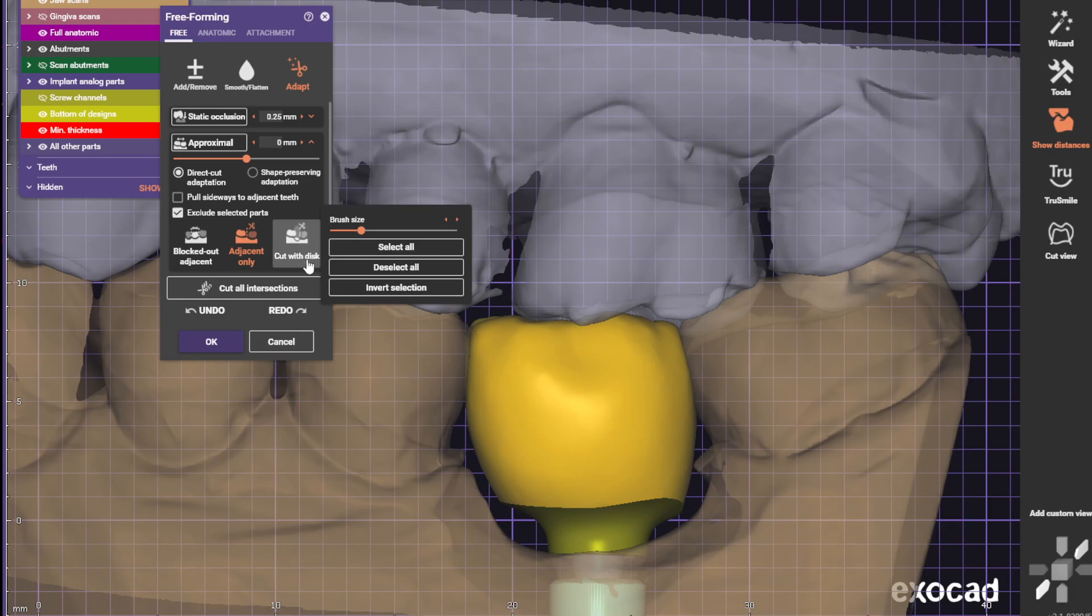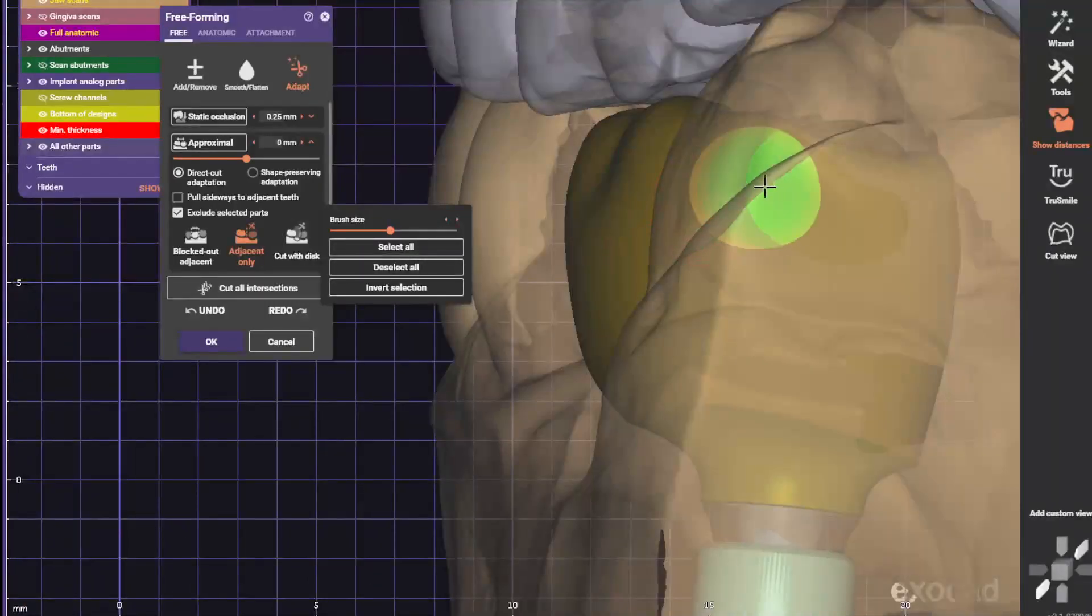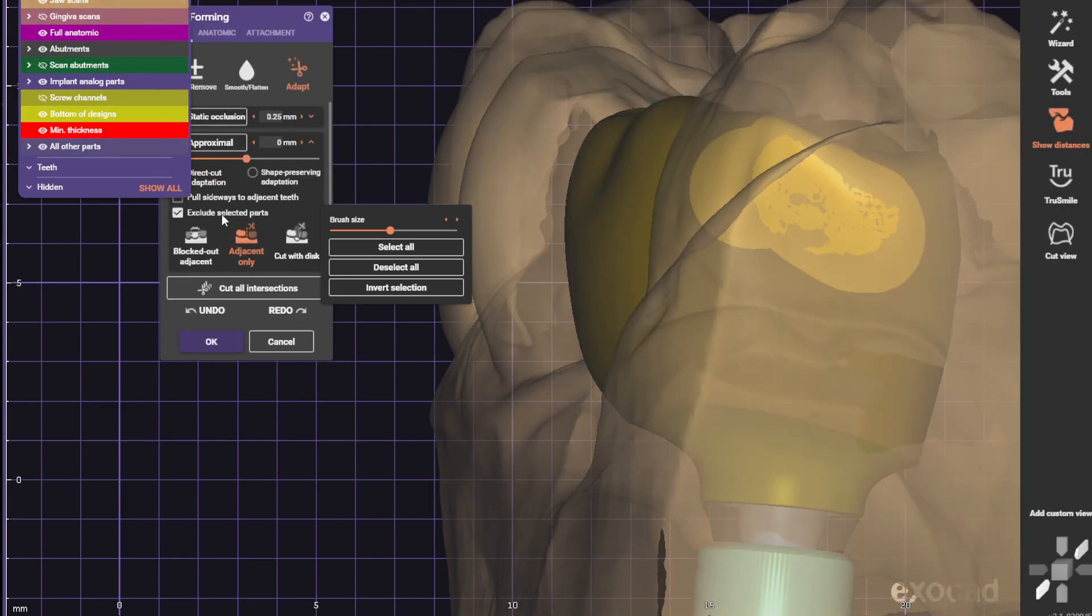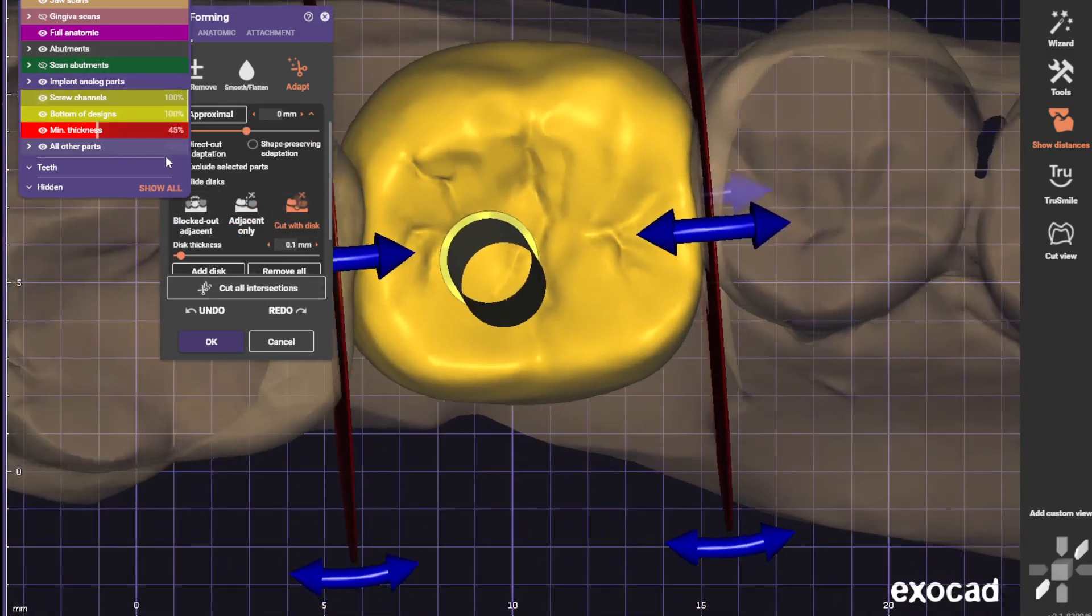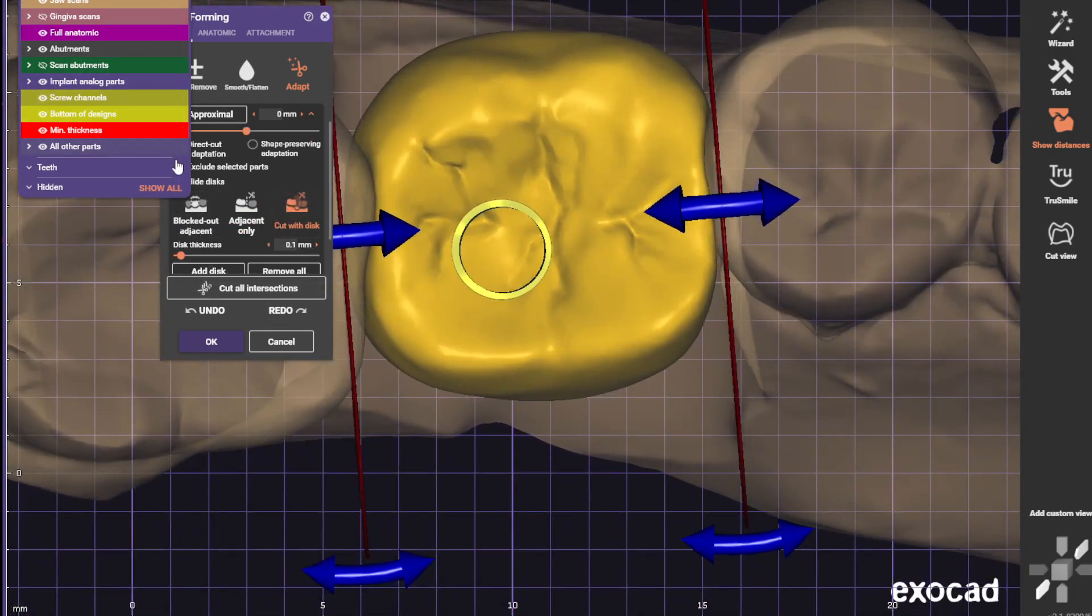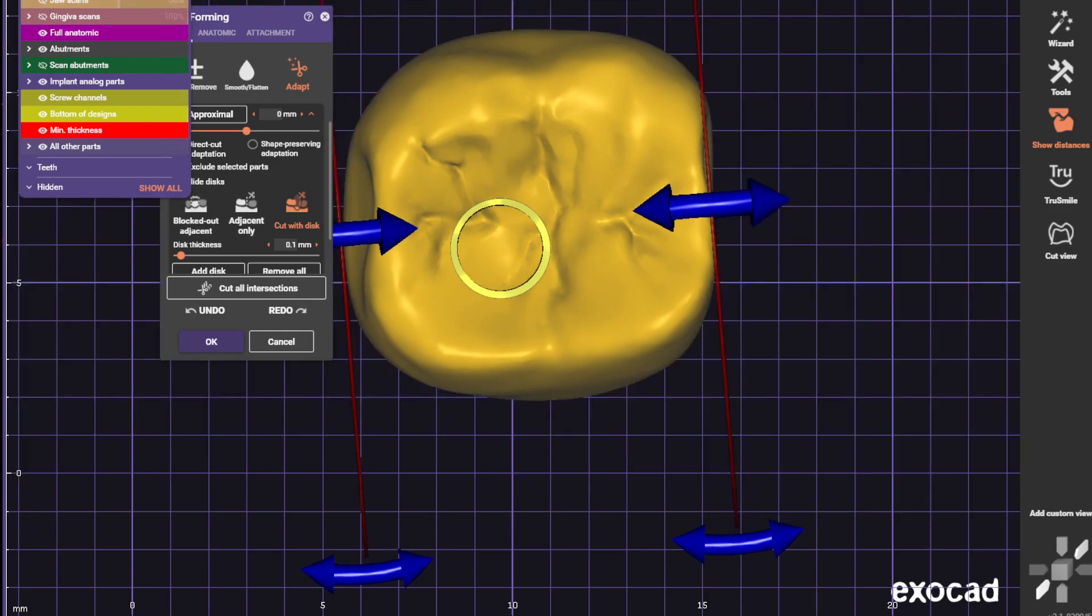Contacts. Cut only selected areas. Cut disk. You can see it does the same insertion direction as the screw hole, which is great. Now we can come over here.